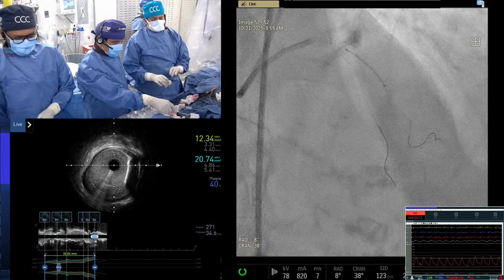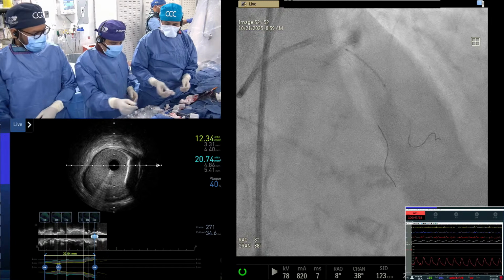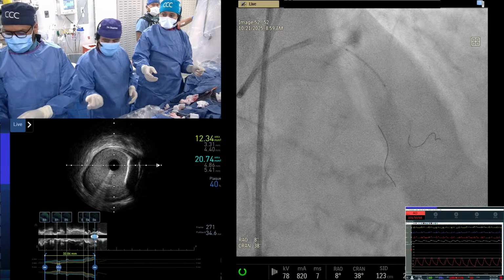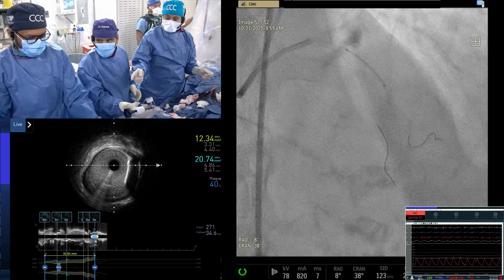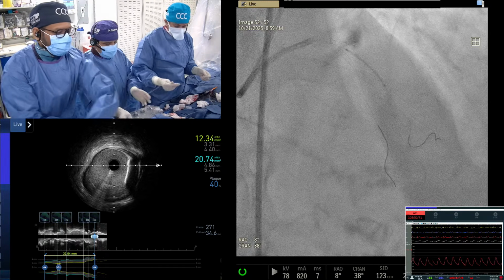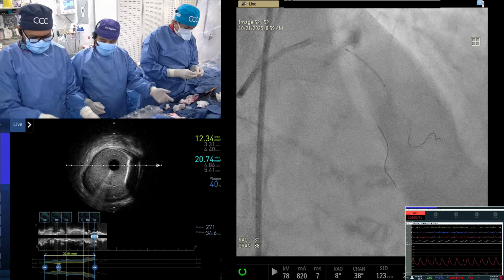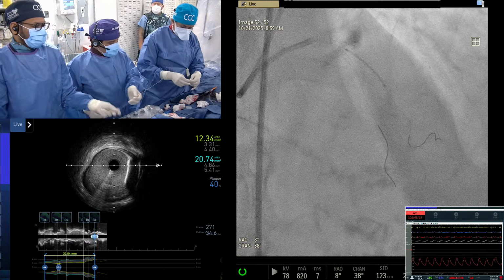And key is to have a different type of inflator so that you remember whether you put a sticker or we actually have the white inflator versus our regular inflator. Which company is the white one? Medalab, okay. And our regular inflators are Boston Scientific? Yeah. So try to just make it so that they are different.